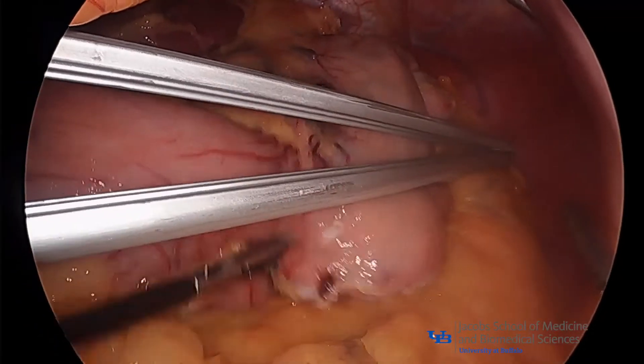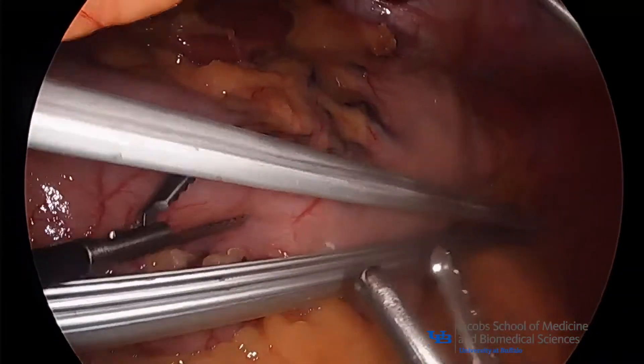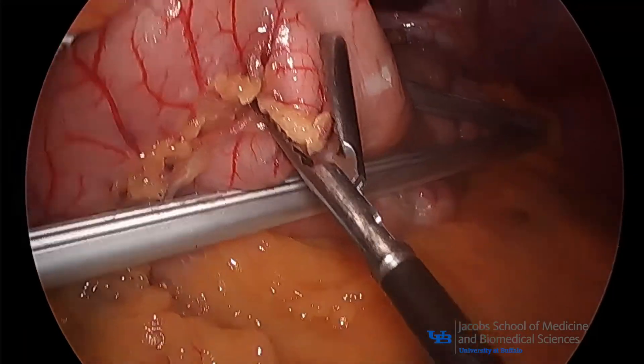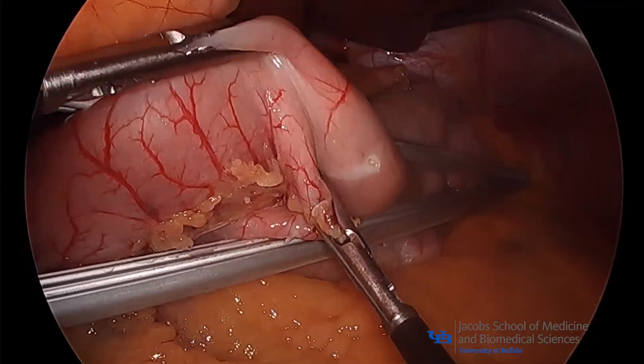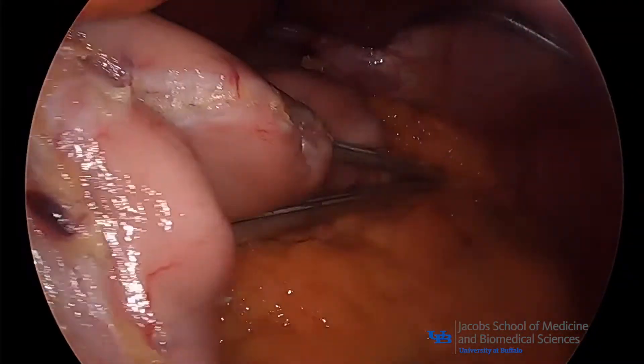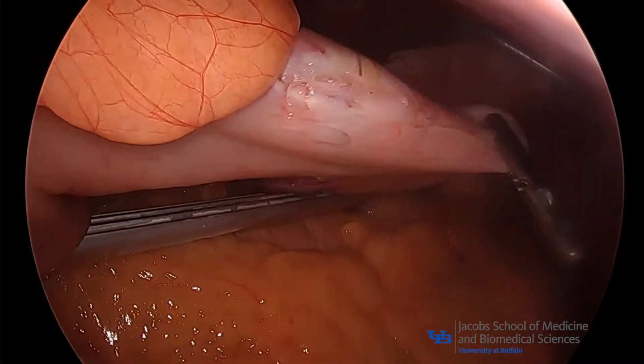The standard clamp is placed across the stomach along an oblique line connecting three identified landmarks: 6 cm from the pylorus, 3 cm from the incisura, and 1 cm from the GE junction. The tip and handle of the clamp should be in the 1 o'clock and 7 o'clock positions respectively.